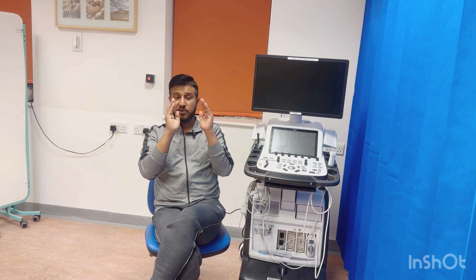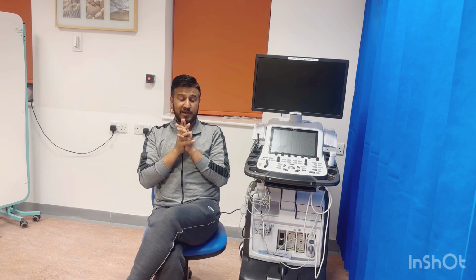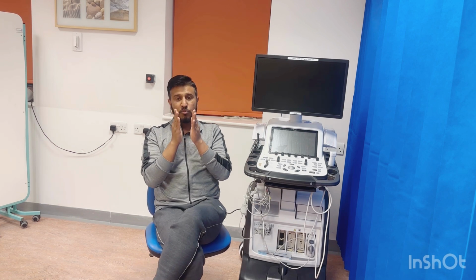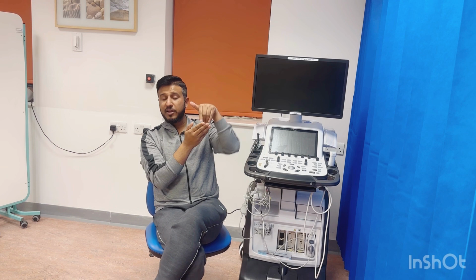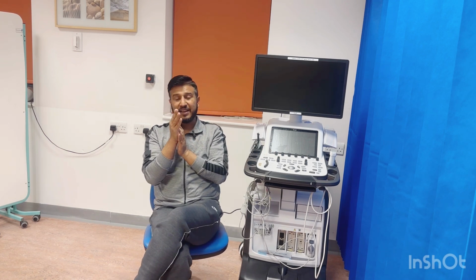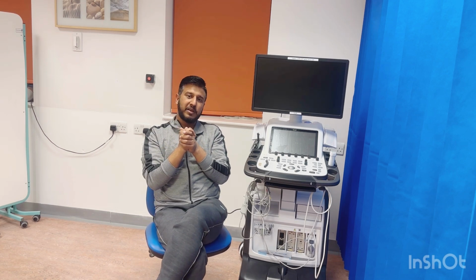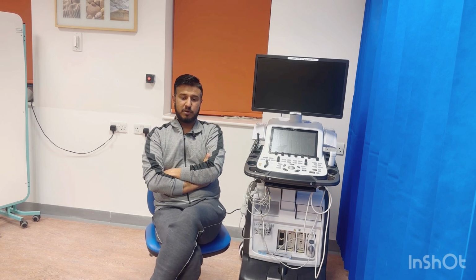Just zoom the image, freeze it, slowly move it. Wherever you see better vena contracta, measure it. Now, in aortic regurgitation especially, most of the jets are not very central. If the jet is central, you can get a very good vena contracta. But if the jet is not central, then it's very tough to measure the vena contracta. You can give it a try still, but it's going to be wrong most of the time.